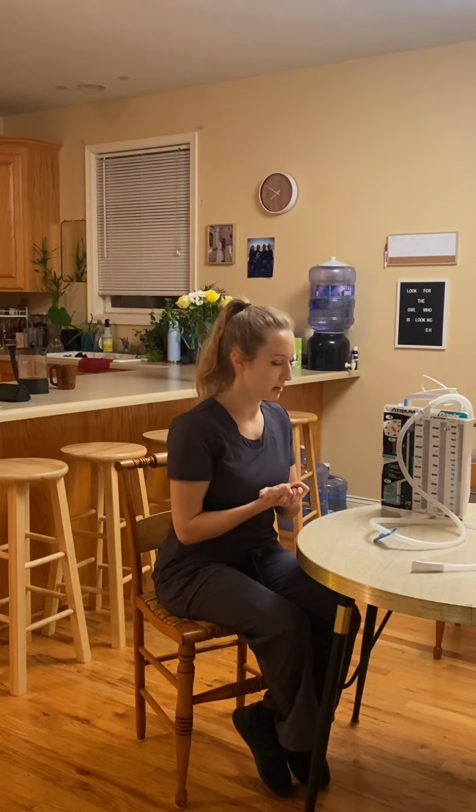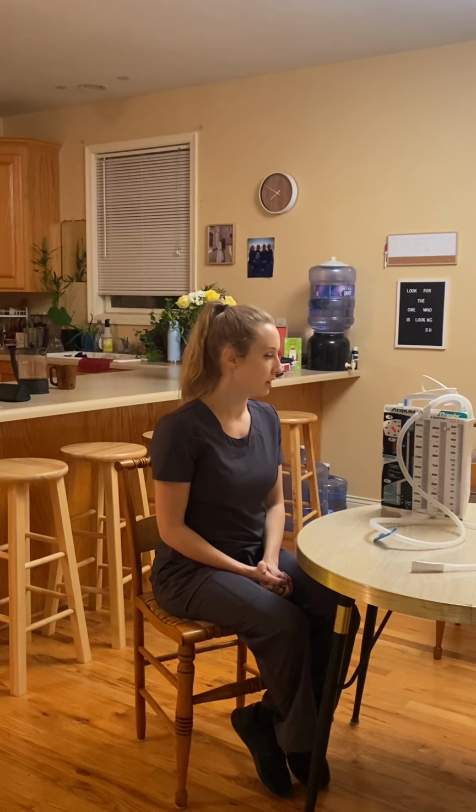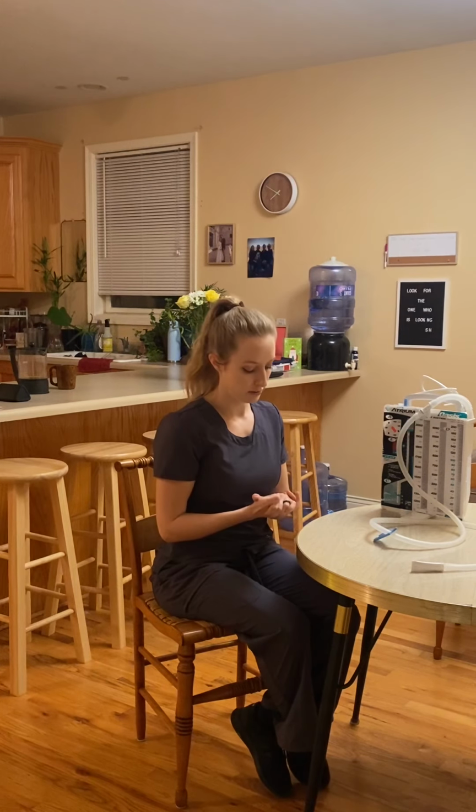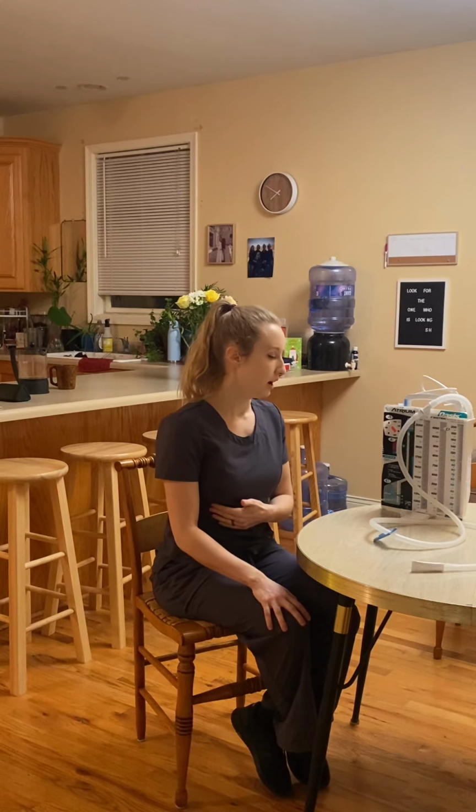Mr. Smith, hi, my name is Grace. I'm going to be your nurse today. You just came out of surgery. You have something called a chest tube in, and I know it causes you some discomfort, so we do have some medications here for you.